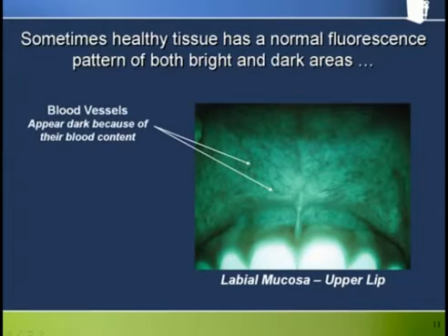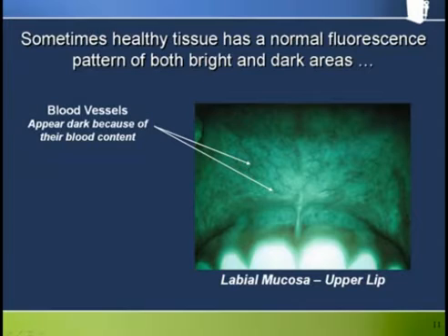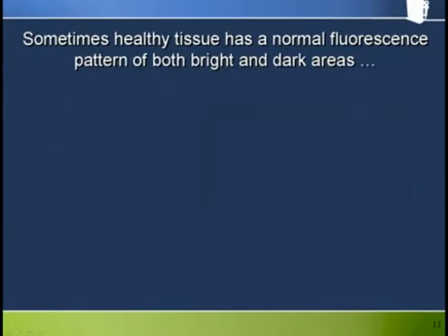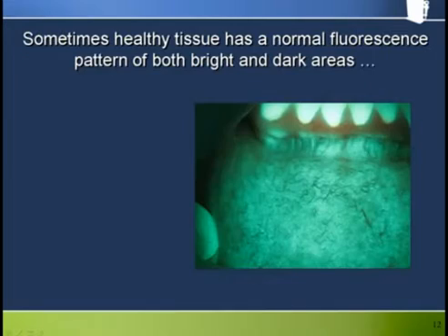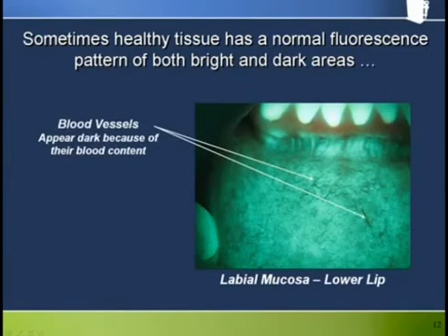This is the labial mucosa on the upper lip, the blood vessels again showing up dark under the scope. Here is labial mucosa this time on the lower lip, presenting similarly to the upper lip.